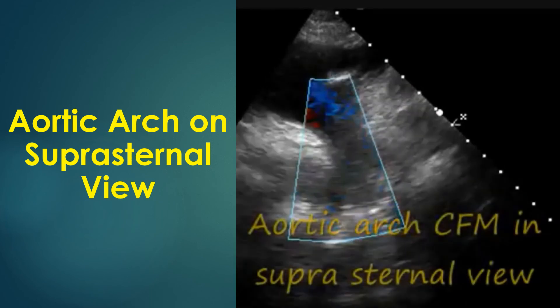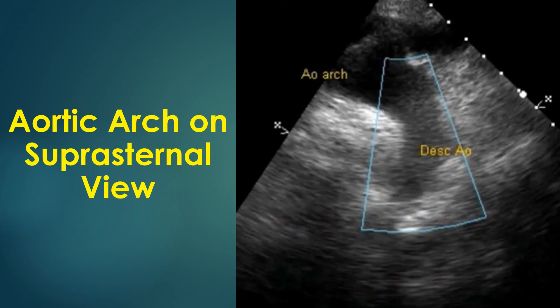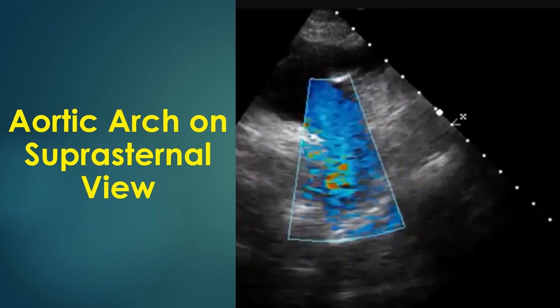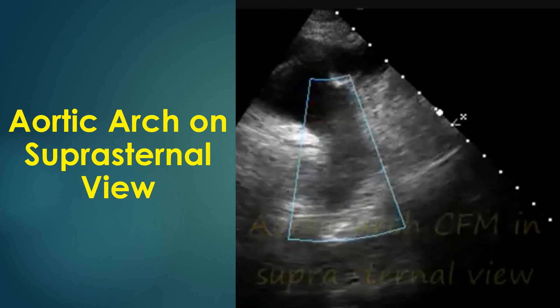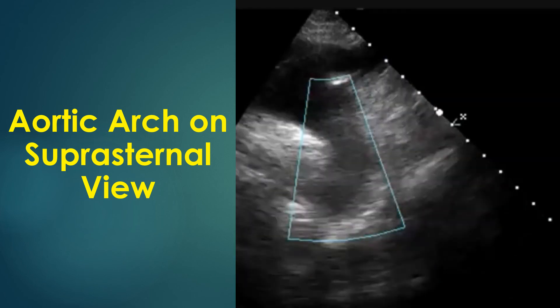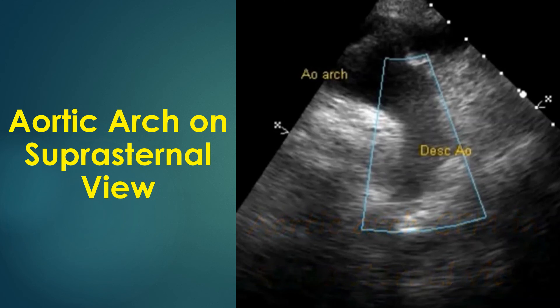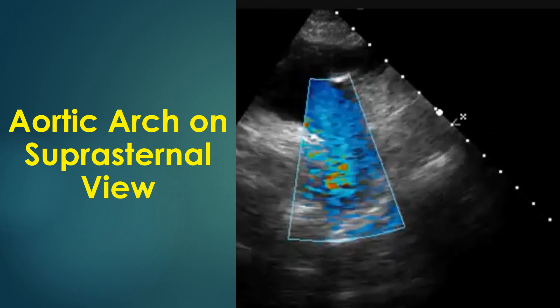The suprasternal view is often the last view obtained during echocardiography. It images the aortic arch and its branches and the proximal descending aorta. This view is used to detect coarctation of the aorta and measure gradients across the coarctation. Ascending aorta can be imaged with a tilt and ascending aortic flow is measured in aortic stenosis to get the gradient across the aortic valve.